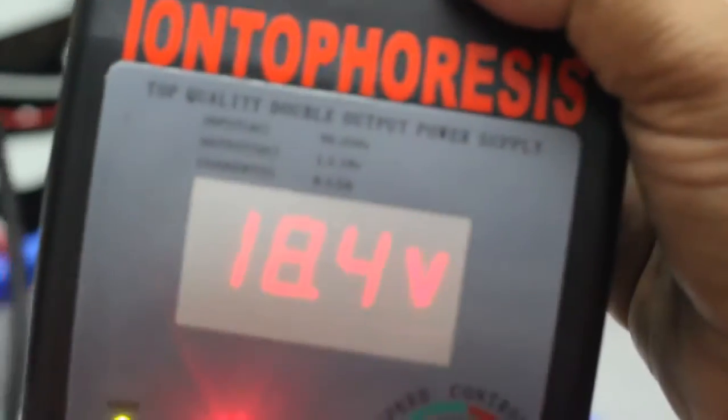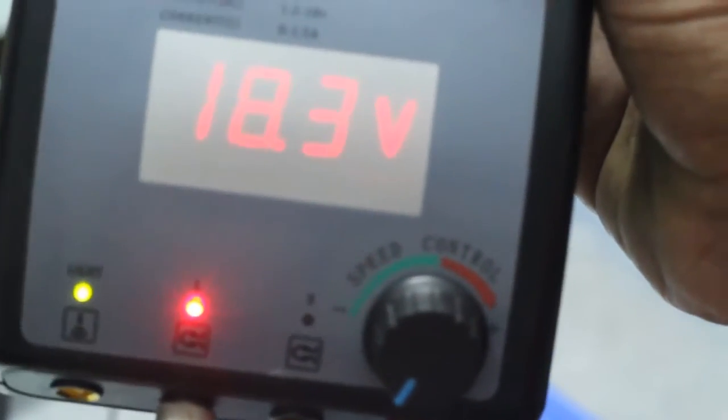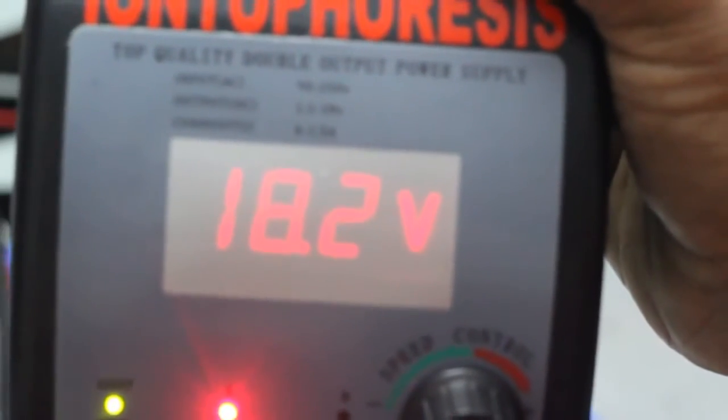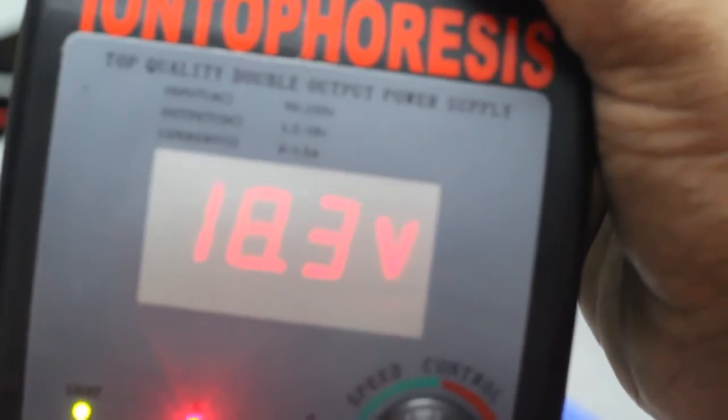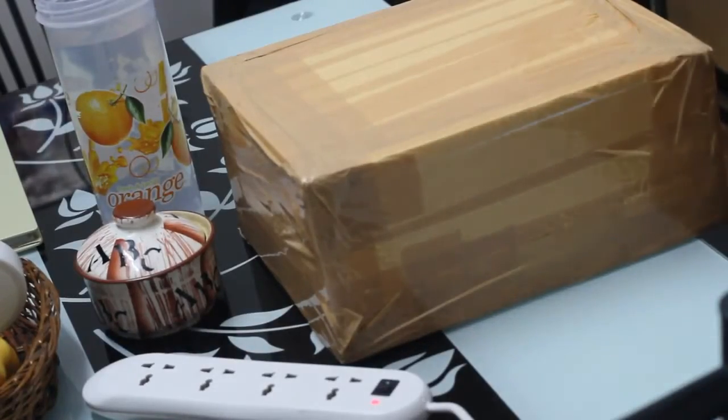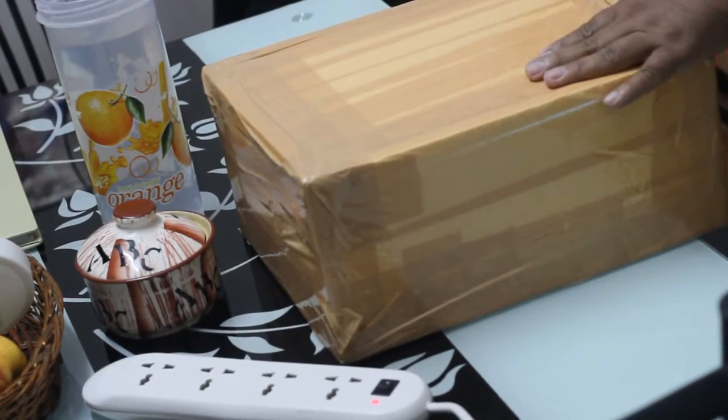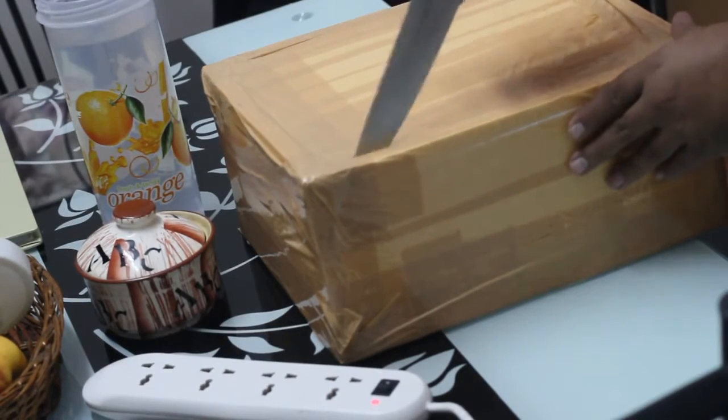Once it is off, the device is eventually off. The maximum intensity is 18.5 or 18.3 in some devices and the minimum is 1.5. The more intensity you do, the better the results for the sweaty palms and feet. It will bring dryness.